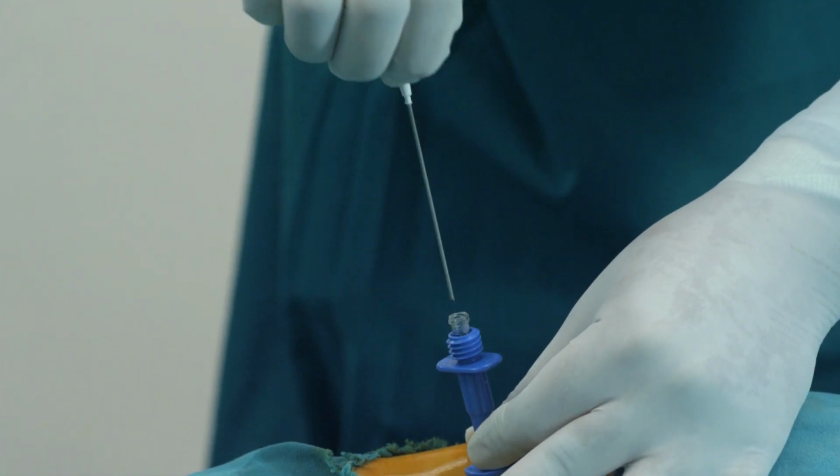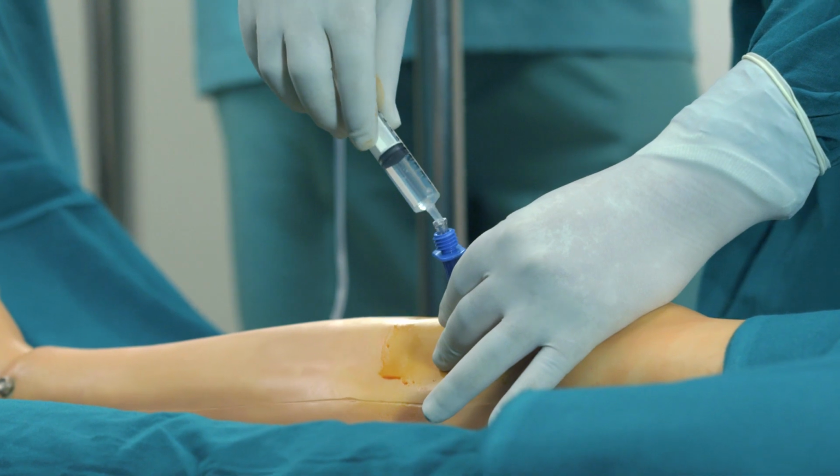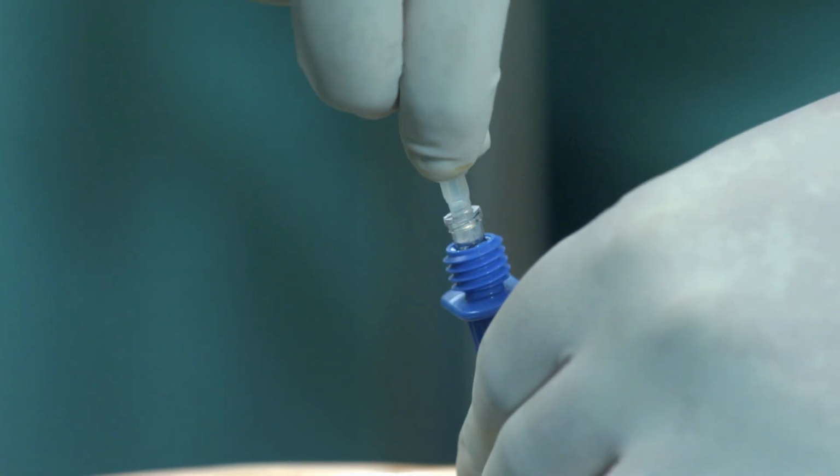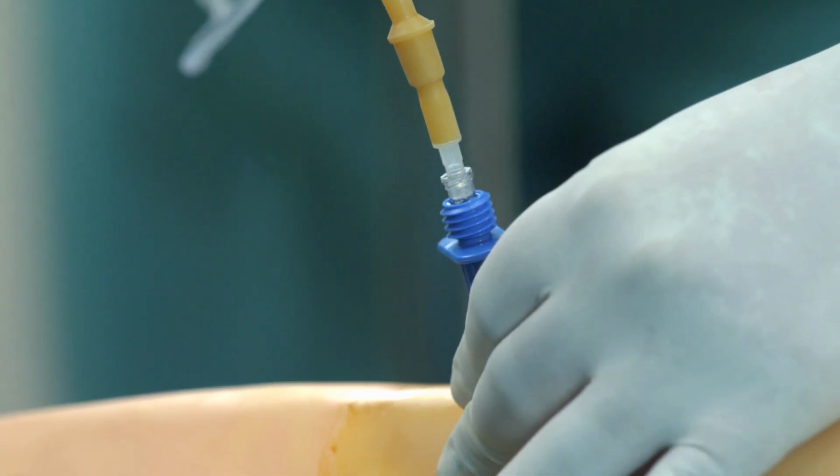Now remove the stylet and connect the 10 cc syringe to the needle. Aspirate for blood or marrow contents or both to confirm correct placement. Make sure that the fluid flows easily with no resistance.